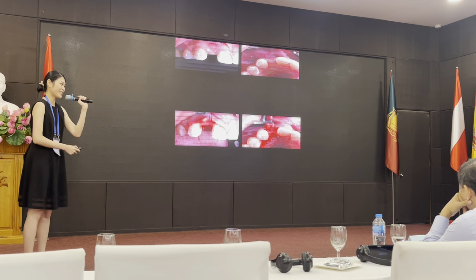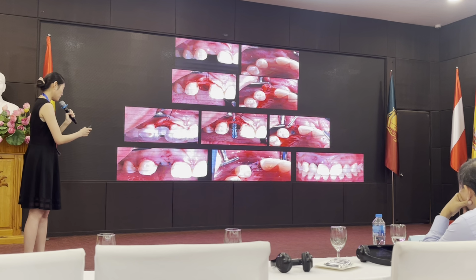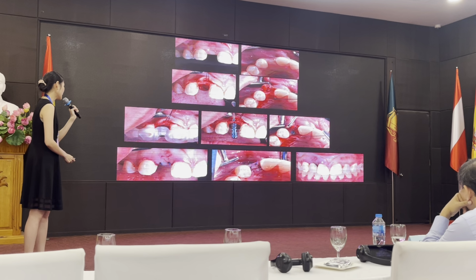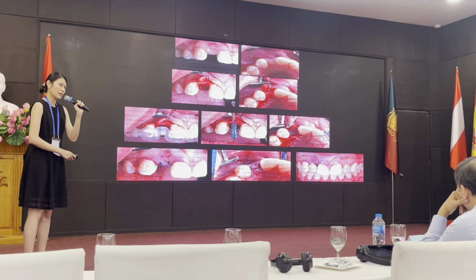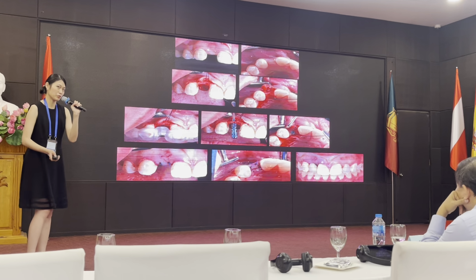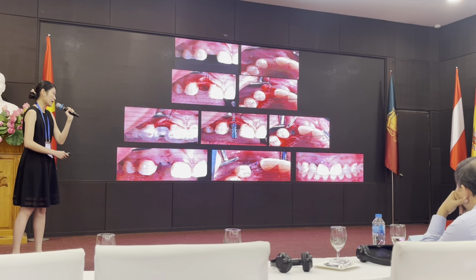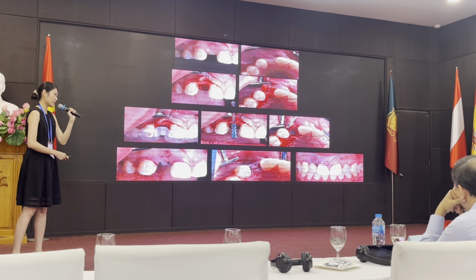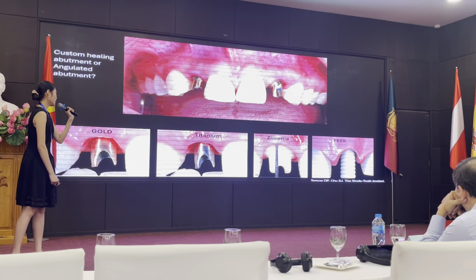And then I just did a very simple mid-crestal incision and opened the flap, and then placed the implant surgical guide on the implant site and then did the guided surgery, and did simple interrupted sutures. And after that, because you can imagine this is a 2.9, and the primary stability probably will not be too good. So what we can do is we can submerge the implant, put the cover screw on, and let the tissue heal. And in this case, we let the tissue heal for 6 months because we want the aesthetic outcome.